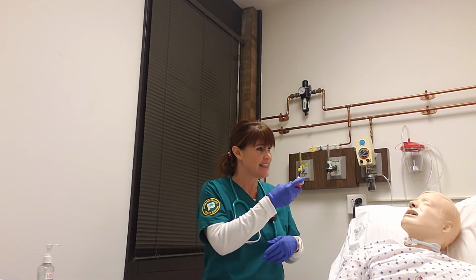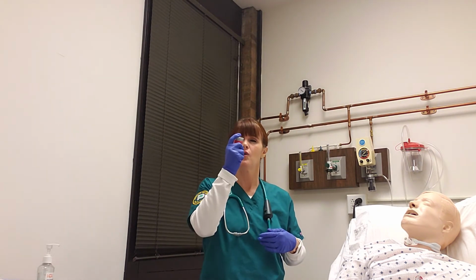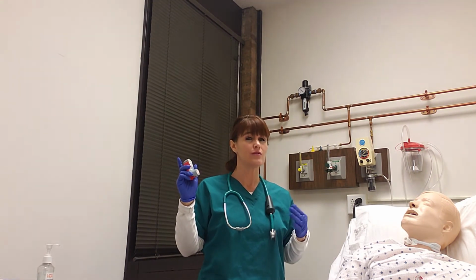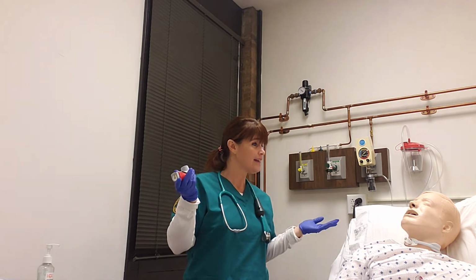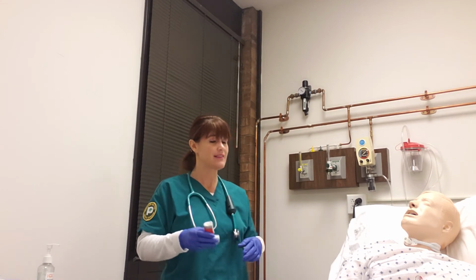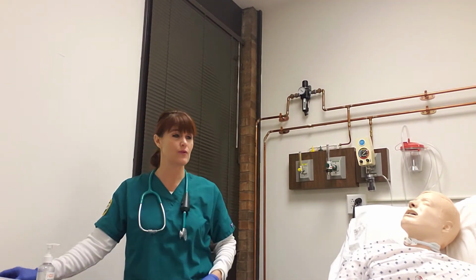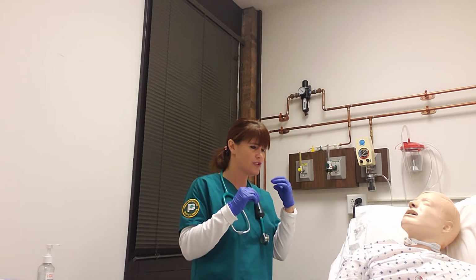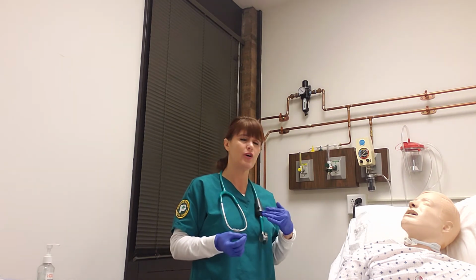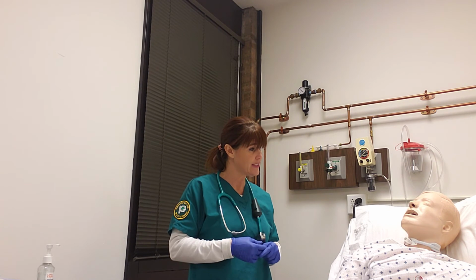So right after you start that, then I want you to hit this directly after you start your inhalation. Okay, so shake it, hold 10 seconds, blow out, shake again, and hold 10 seconds. Okay, and then you will be done. All right, with this one, it's corticosteroids. So the next thing I want you to do is to take a drink, rinse your mouth real good, swish it around, and then spit it out. You don't want to swallow it. Just rinse and spit. Okay, do you have any questions?